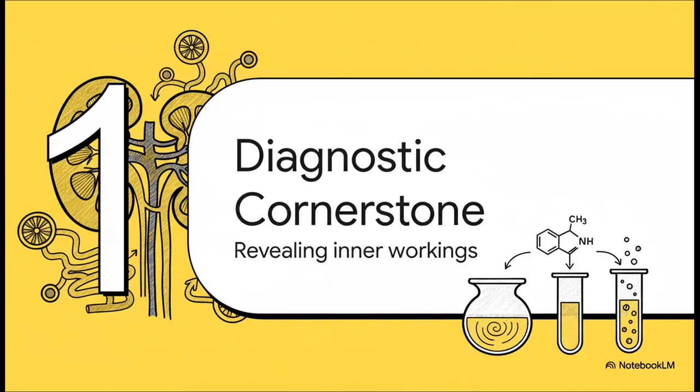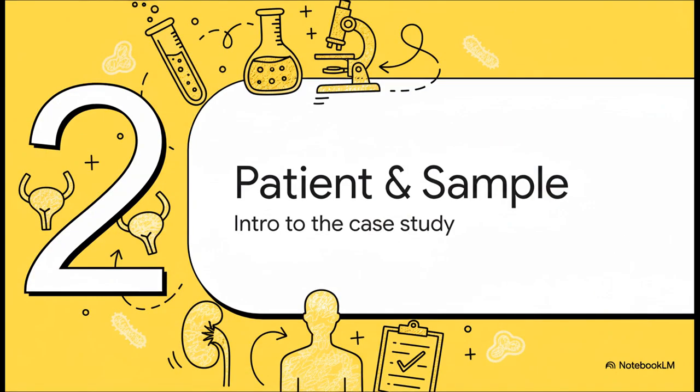Okay, so first things first. The routine urinalysis, which you'll almost always see shortened to just UA, is a true cornerstone of lab medicine. It's a test that looks at the physical, chemical, and cellular properties of urine. This gives us an absolutely crucial snapshot of a patient's fluid balance, their metabolic state, and, most importantly, how well their kidneys are functioning.